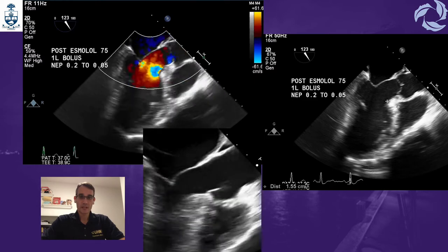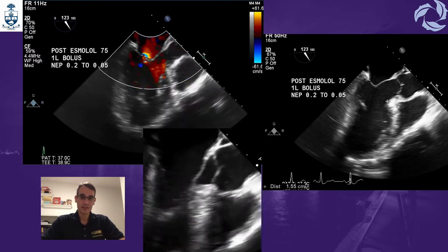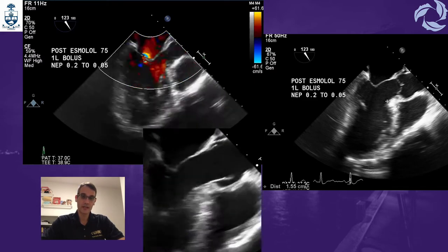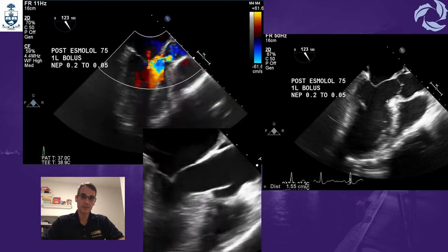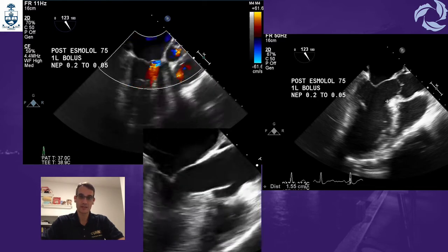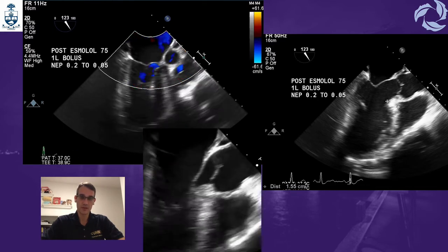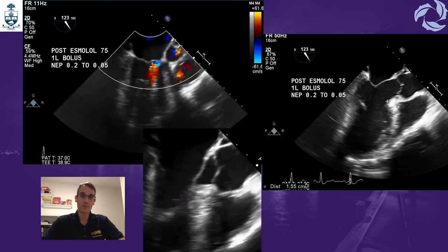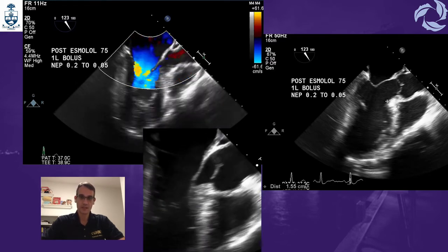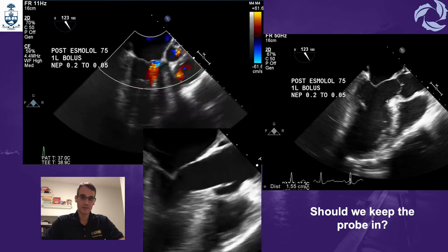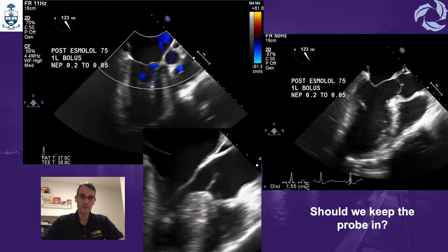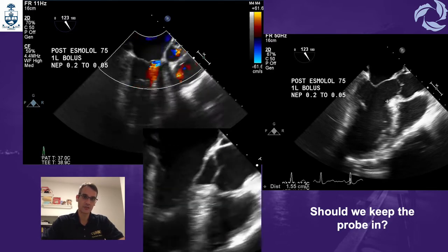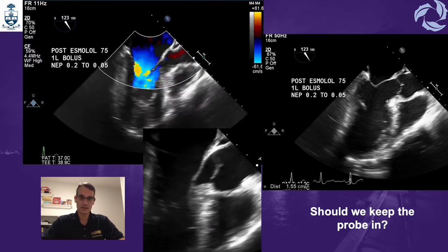This is the ideal image to measure the thickness of the LV, comparable to the parasternal long axis in transthoracic echo. We measured a septum of 1.55 centimeters. Anything more than 15 millimeters is considered severe septal hypertrophy, and it should be measured in end diastole.